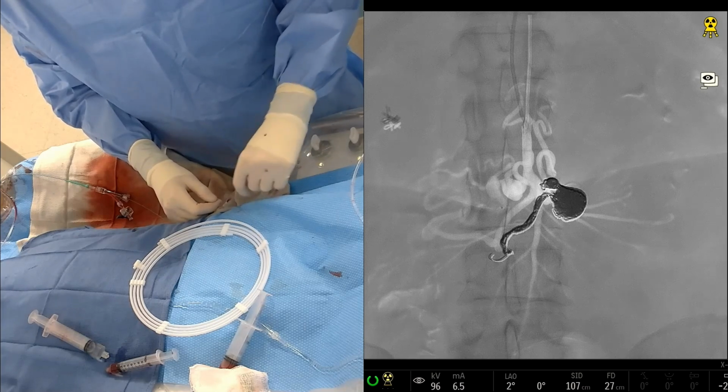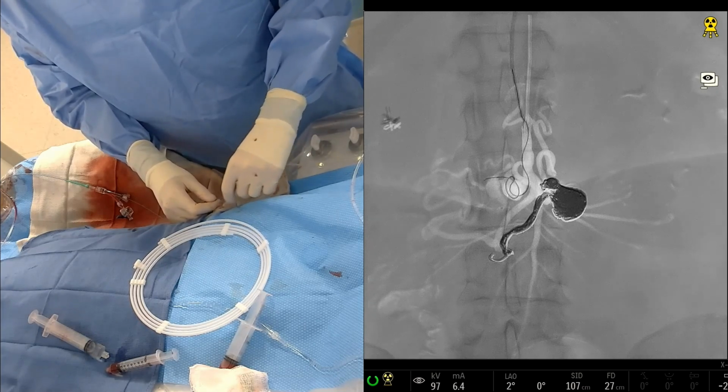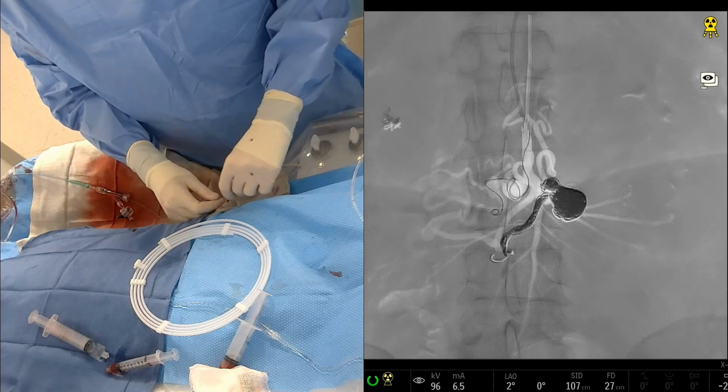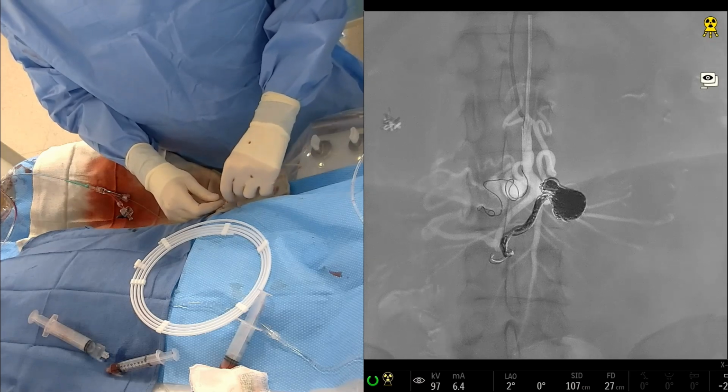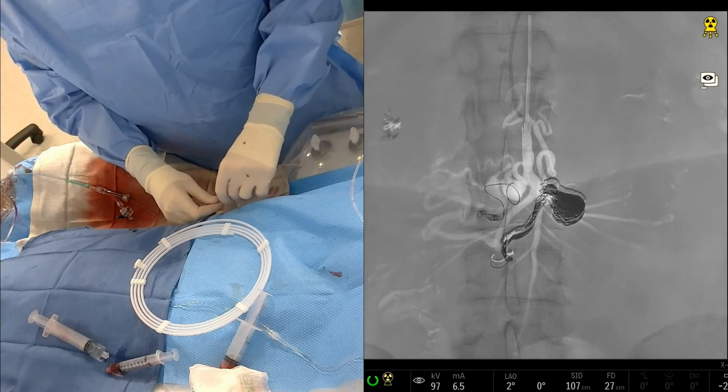So what do I think we would do here? This is a 4x15. You can see the coils are taking these turns fairly straightforwardly, without too much issue. Okay. I'm just going to let it go.